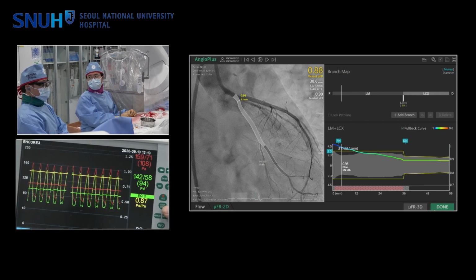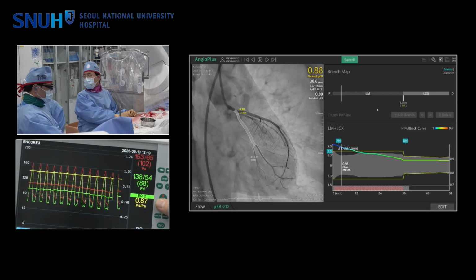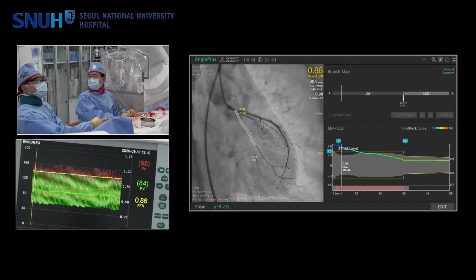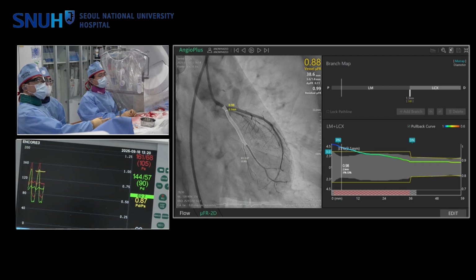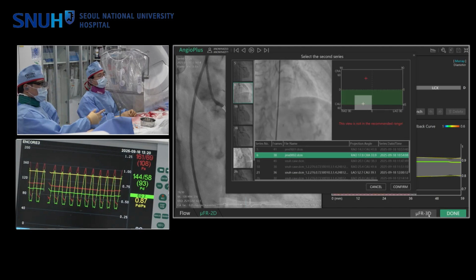And UFR is so somebody can manipulate the number. Yeah, how about UFR level? UFR digit 나왔으면 이야기를 해줘. 은밀하게 저쪽으로 넘기지 말고 우리가 모르는 사이에. Yeah, I'm going to pull back the pressure wire. Somebody shows that pull back the pressure wire. UFR number can change from 0.57 to 0.88. UFR은 88 나왔습니다. 그 전에 얼마였지? It is very operator dependent.